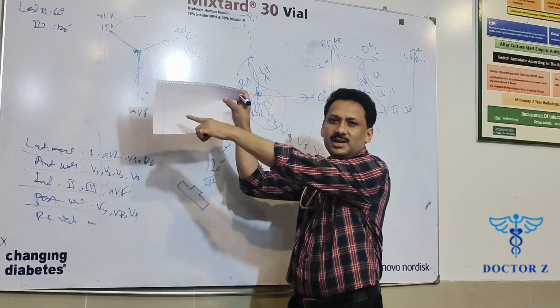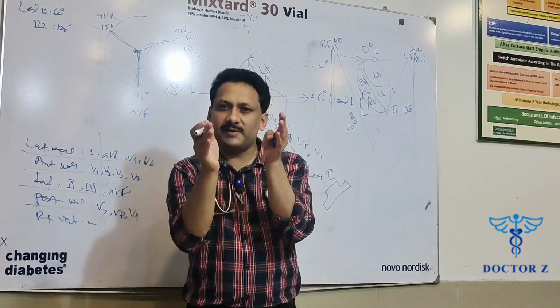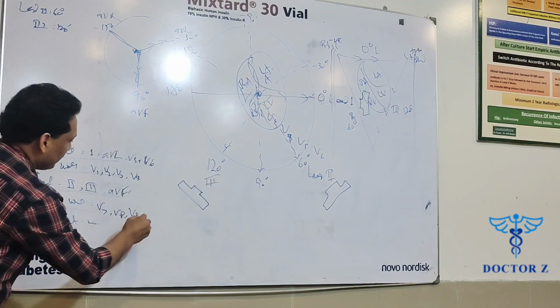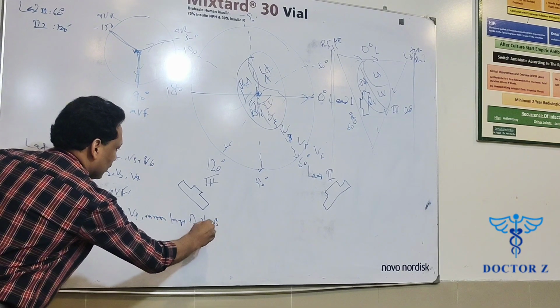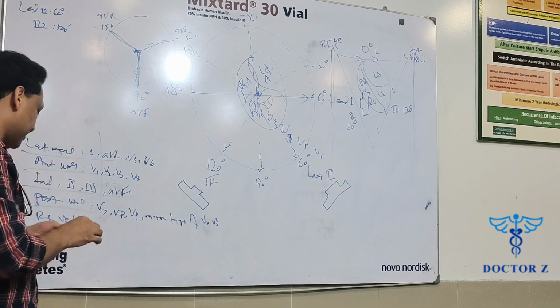So you need to see the mirror image of V1, V2, and with that mirror image, you can comfortably interpret that posterior wall. So there are two ways: the mirror image of V1, V2, and then obviously V7, V8 and V9. That's the other way out.